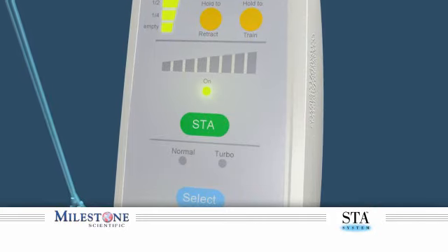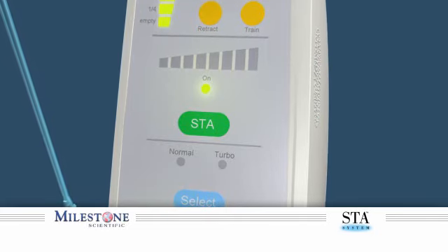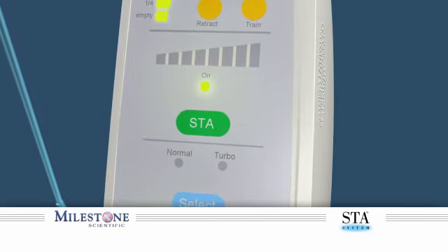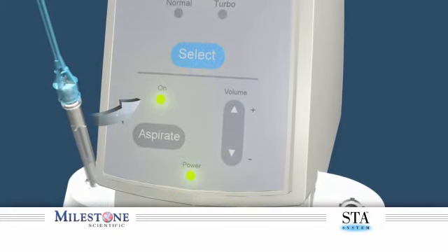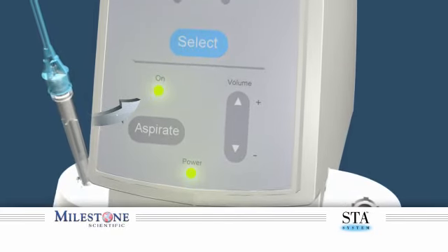Please note it is critical to use the STA mode for this injection to ensure that a safe and controlled single flow rate is maintained throughout this injection. Delivering the anesthetic at a faster rate than the control flow rate can result in adverse tissue reactions and/or tissue damage. Make certain the aspiration feature is on, as an aspiration test may be performed during the anesthetic delivery.